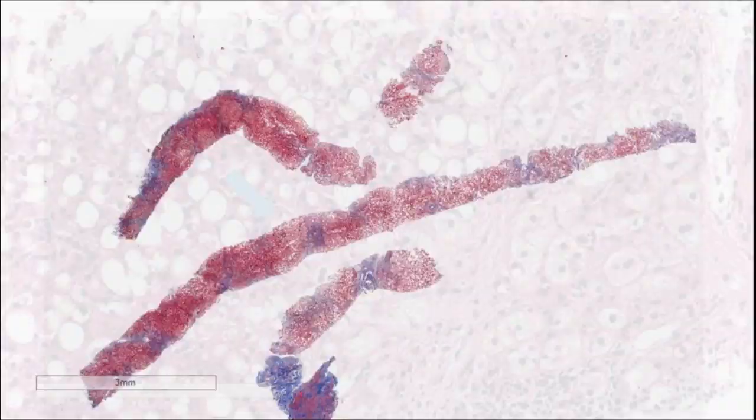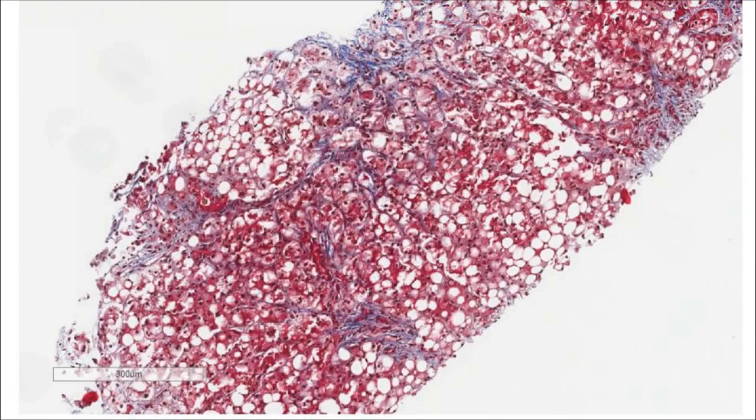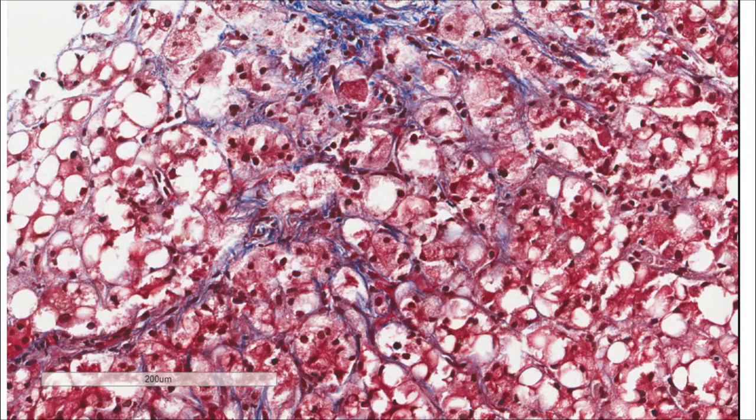At low power, the trichrome stain shows that there is portal fibrosis, and in some cases there may be focal bridging from portal tract to portal tract. As we go higher power, we can also see, as with our first case, some of this pericellular fibrosis, space of Disse fibrosis, that is, again, very typical for steatohepatitic patterns of injury. In contrast, the type of fibrosis with the usual hepatitic, viral or autoimmune hepatitic patterns of injury is very clean and smooth bands of fibrosis. This space of Disse fibrosis, again, is typical for steatohepatitic patterns of injury. And on higher power, you can see how that fibrosis is pericellular, and particularly around the steatohepatitic or ballooning degeneration of those hepatocytes.